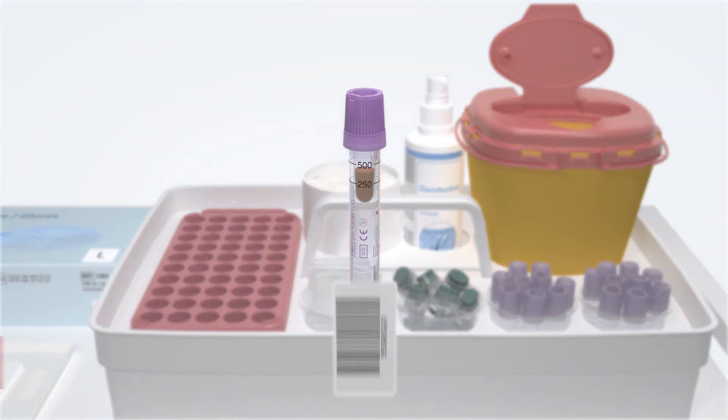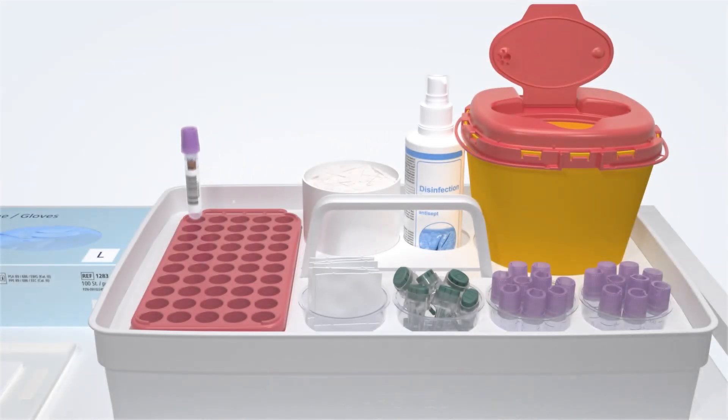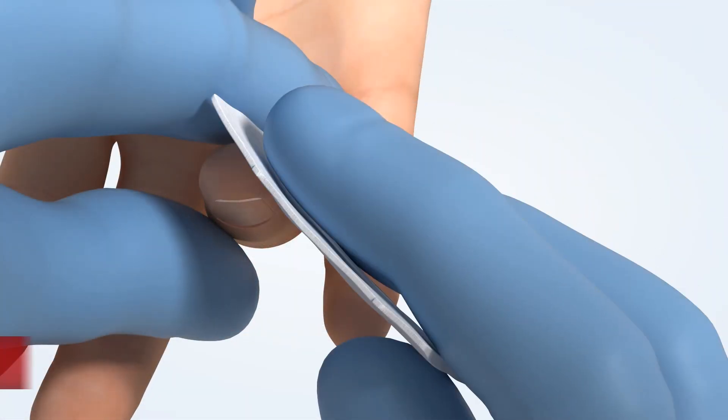Affix the patient label on the MicroVet APT and place it in an S-Monovet rack. Wipe the puncture site with a swab and apply a plaster.